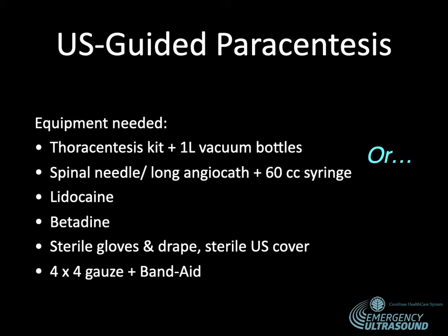So when I go to do this procedure, I want to first decide, am I doing a diagnostic paracentesis and trying to send a little bit of fluid to the lab to identify maybe underlying infection or potentially help me identify the cause of ascites? Or am I doing a therapeutic paracentesis and the patient has liters of fluid in their abdomen and I'm just trying to help them feel more comfortable? So each one is a little bit different. When you do large volume paracentesis, you need to think about how much fluid you might be draining off and whether you'll use albumin or not if there's a need, and that's a different lecture for a different day.